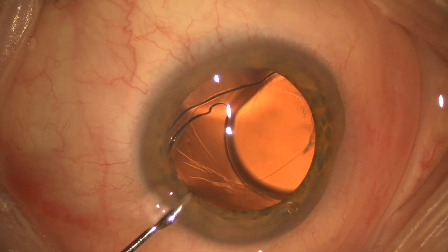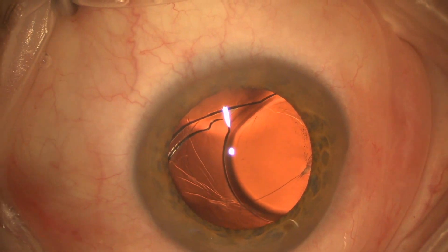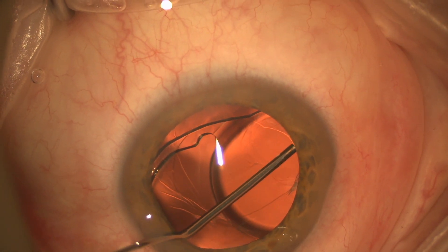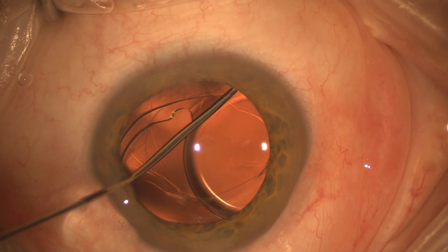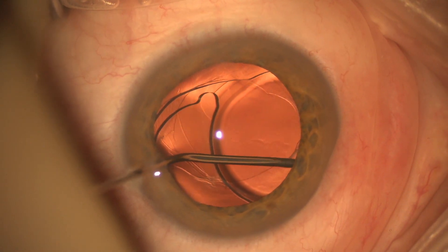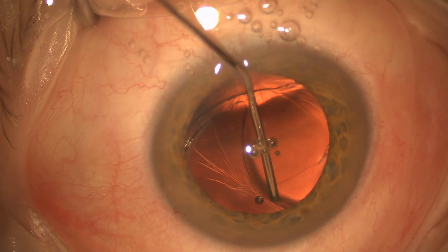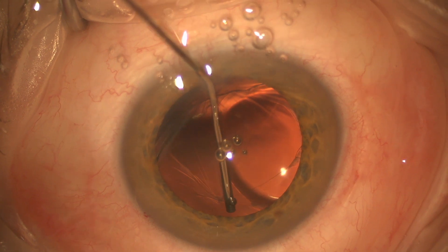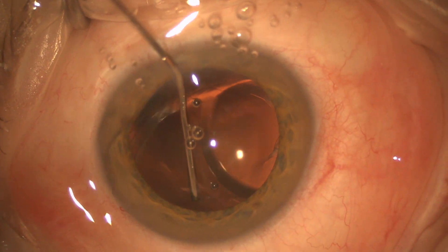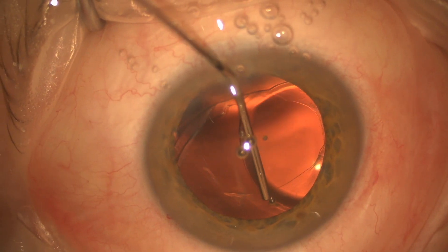We're going to recenter the IOL. We have lots of bag to work with, so that makes it easier. We're reopening the main incision here, and basically we're going to do a generous viscodissection of the lens from the bag — trying to free up the lens out of the bag. At this location you can see the anterior capsule is actually fused to the posterior capsule, and right there you can see that we're able to put enough viscoelastic in there to dissect that open.